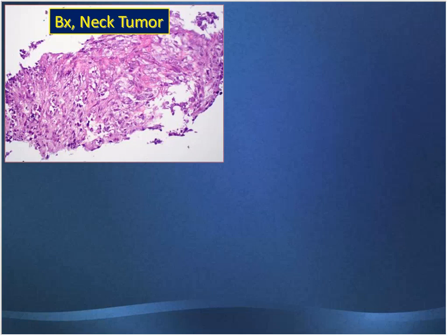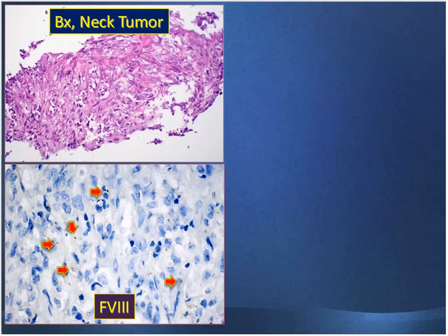ERG also, as a marker for endothelial cells, is not that specific. Factor VIII related antigen is more specific, but unfortunately is not as sensitive. The reason I'm mentioning that in this particular case with that history, the other markers were not helpful, but we had a punctate staining for factor VIII related antigen that those arrows will show you next to the nucleus of many of these cells.